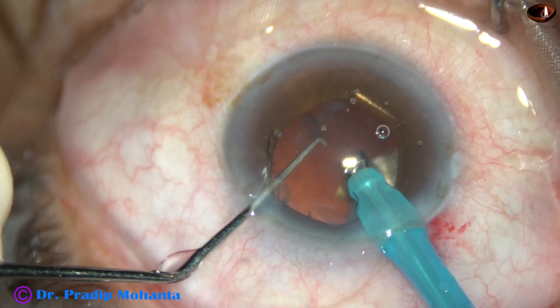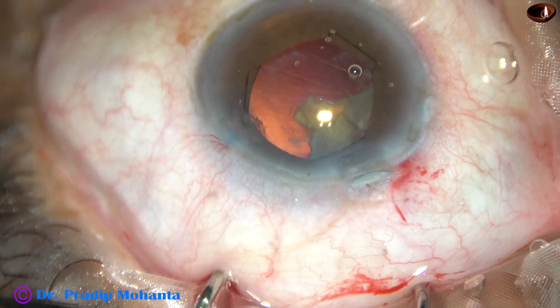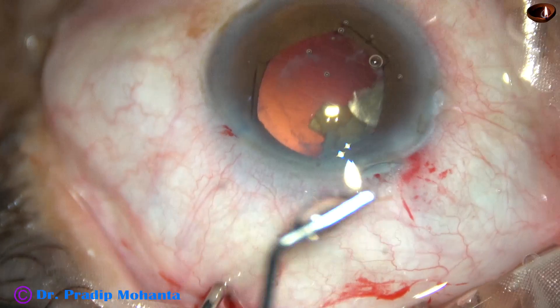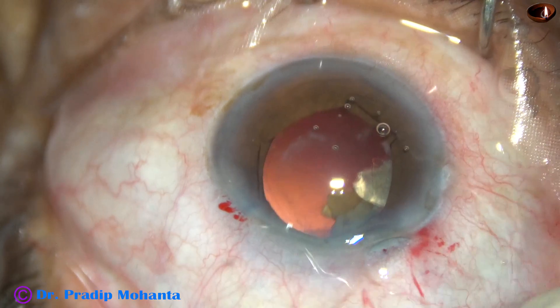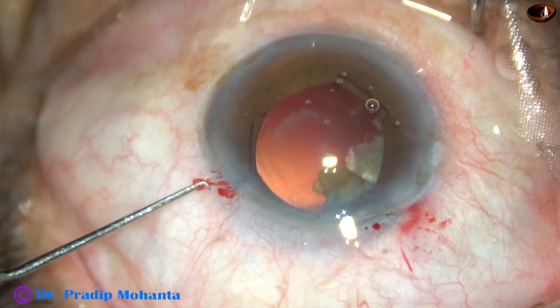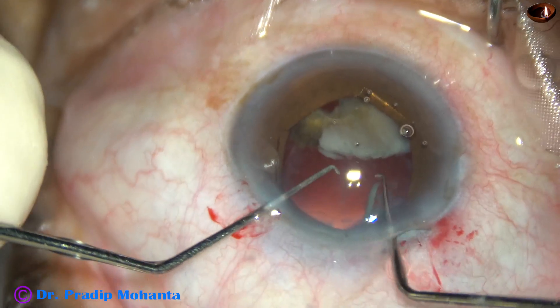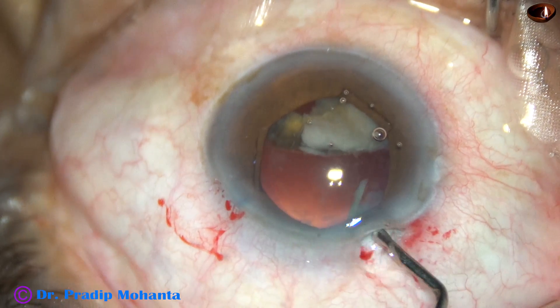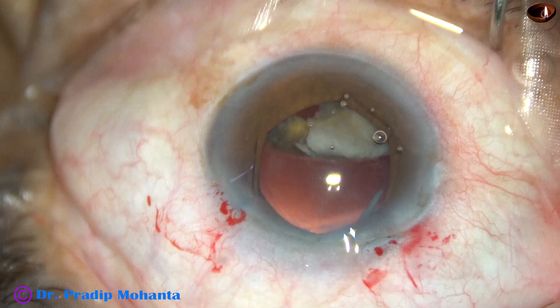See what I am going to do in this case. I have emulsified five fragments. I came out — I want to inject some visco and then partially emulsify the last piece. In this case, since there is no epinuclear cushion, no epinuclear substance covering the posterior capsule, I am going to use an intraocular lens to protect the posterior capsule. So before emulsifying this last nuclear fragment, I am going to implant the intraocular lens.